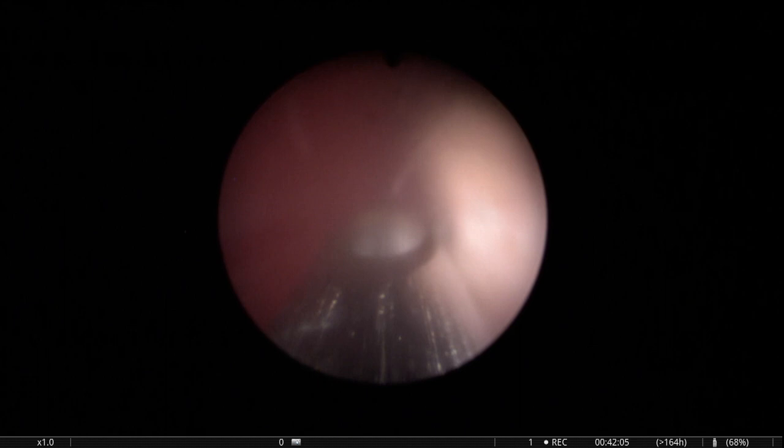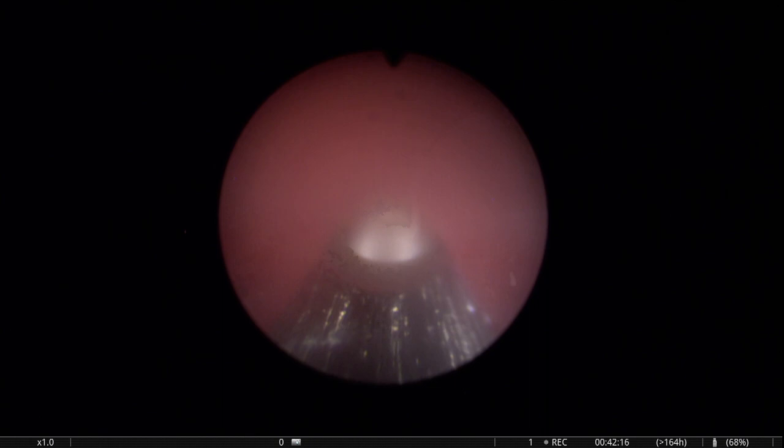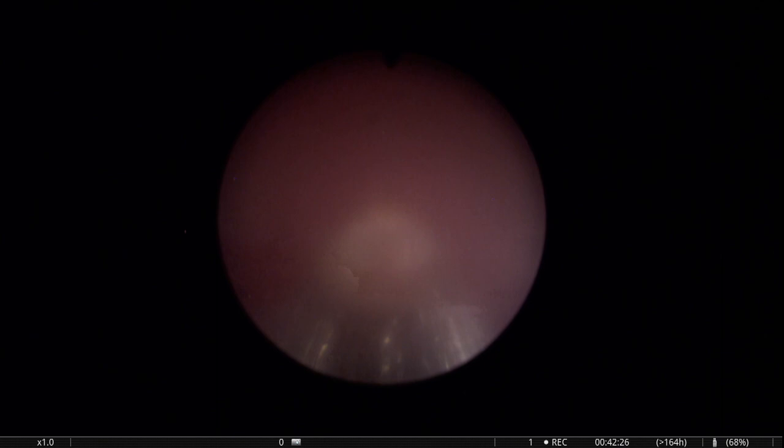So I'm very excited to see that we get pulse modulation lasers, we get fast morcellators. I think soon we will have a lot of options for miniaturized endoscopes. So instead of using a 26 French, we can use a 24 French, 22 maybe. So it would be very nice to have better hemostasis and like that. So here, I think the morcellation of the big piece has finished, but I decided to have a last look.